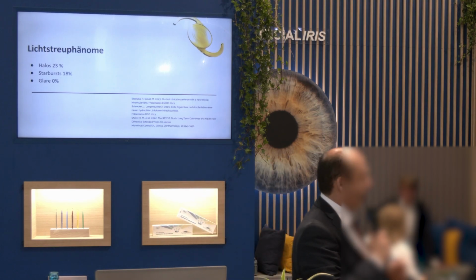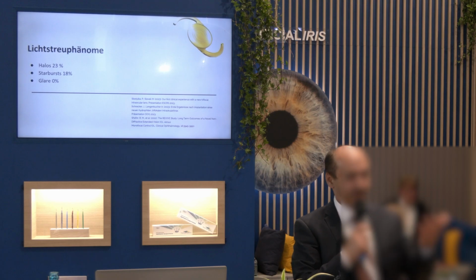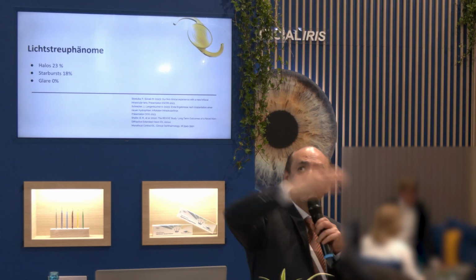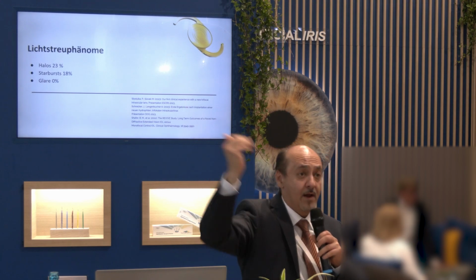So now, of course, the question is: there is a diffractive element, so you must also have halos. Yes, of course you have halos. They are there. But you have to remember that the strength and the expression of the halos depends on the area of the diffractive element. If you only have 30 to 35% of the amount of light from the diffractive element, you only have 30% halo production, and not like other lenses, where the diffractivity across the entire lens goes above 100%. That makes a big difference in how much light you chase through the diffractivity.